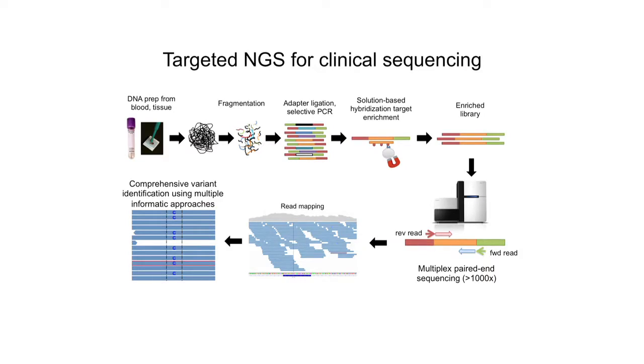And so the paradigm from this paper is really what we've implemented at WashU and what a lot of people in clinical labs have implemented, and it's shown here. I made this slide many years ago now, but it essentially outlines what Mary-Claire and Tom Walsh did.